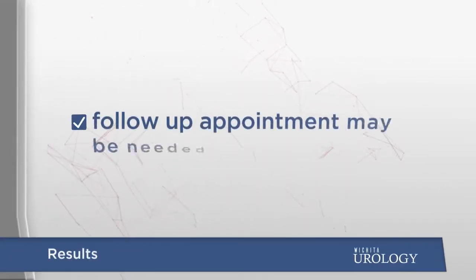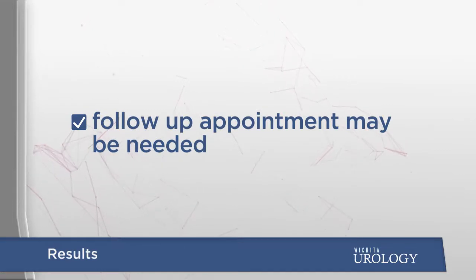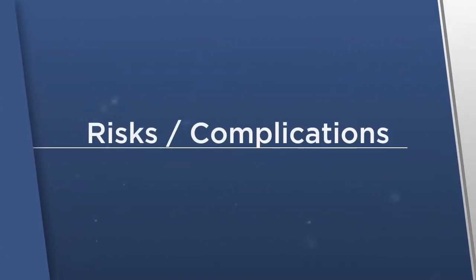Results of cystoscopy. Following your procedure, your physician will discuss your results. If a biopsy is required or your physician needs to remove any abnormalities, a follow-up appointment will need to be made.